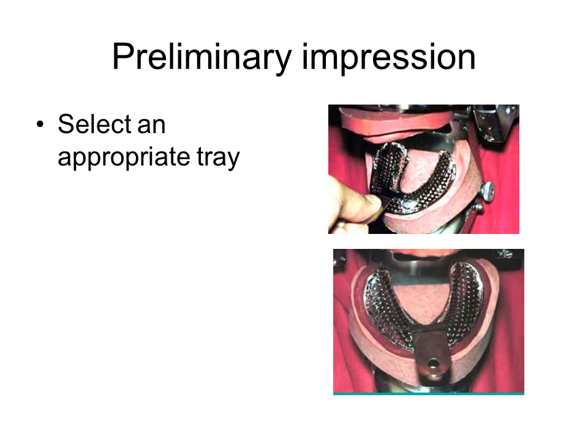Practice placing the tray. Ask the patient to open halfway. Insert the tray by rotating the tray until it is over the center of the ridge. Seat the tray, lift and protrude the tongue, and then relax the tongue. Alternatively, ask the patient to lick their upper lip.